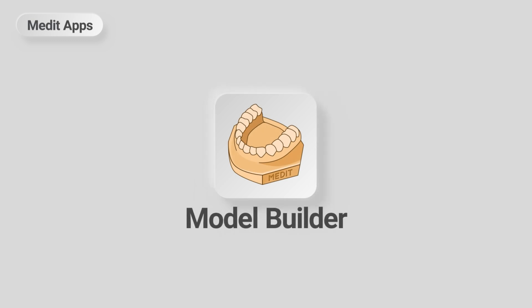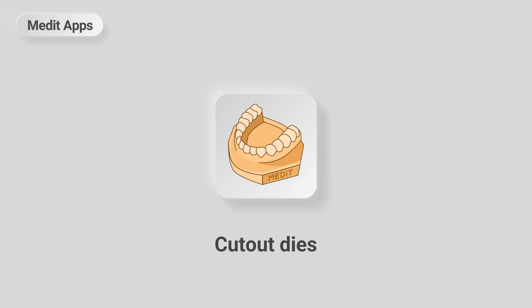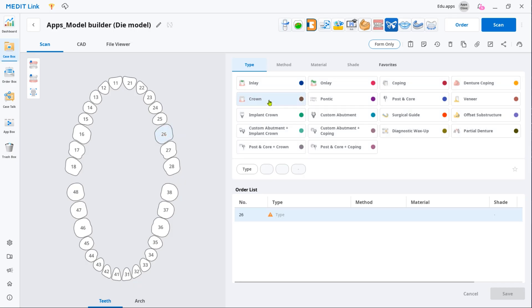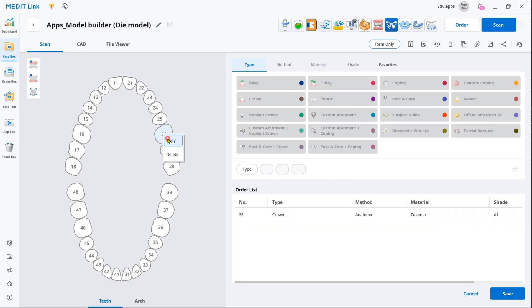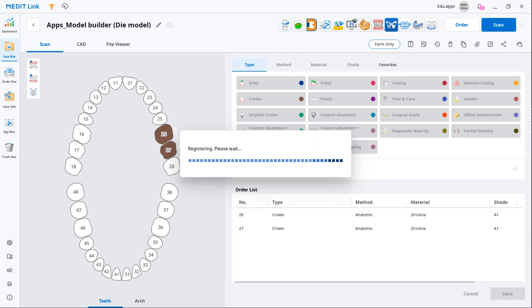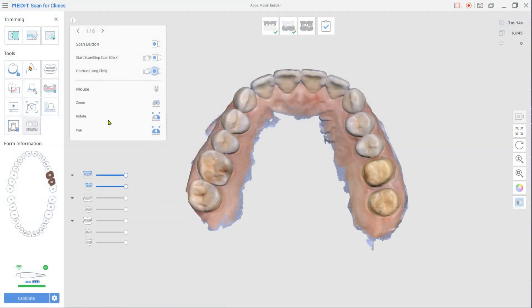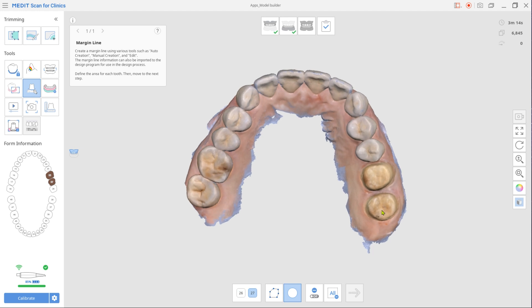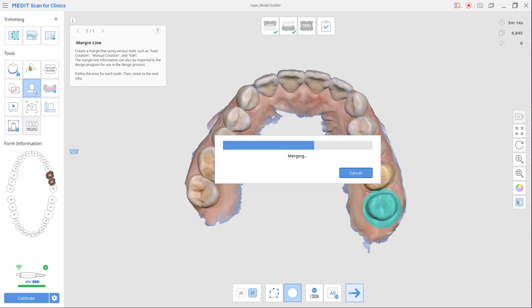This is a quick guide on how to design a model with detachable dies using the Model Builder app. You will need the scan data to work in the app. Create a new case, select Designated Restoration as product type and then scan both arches. A useful tip here is to create margins in MeditScan for Clinics so they could be later automatically imported to Model Builder.